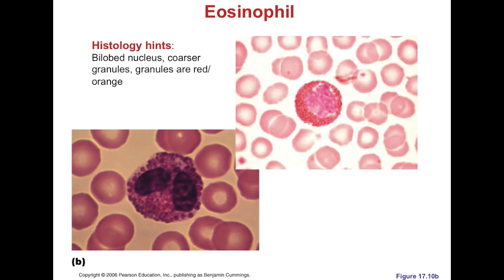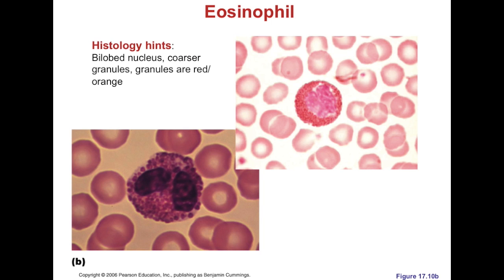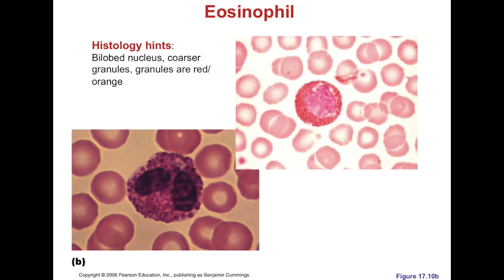Basophils, one more thing about eosinophils. Take a look again at that percentage. They are 1 to 4% of leukocytes, so these are going to be hard to find. You're going to be searching around, looking at neutrophils, and you'll think, oh, I think I've run into a bunch of eosinophils. And you'll think you see like 5 of them. Chances are you're actually looking at neutrophils rather than eosinophils. Eosinophils are really rare, so you're going to have to search a while to find them.